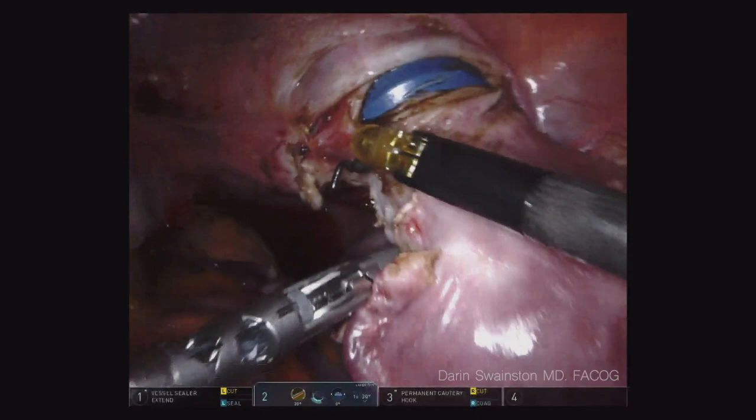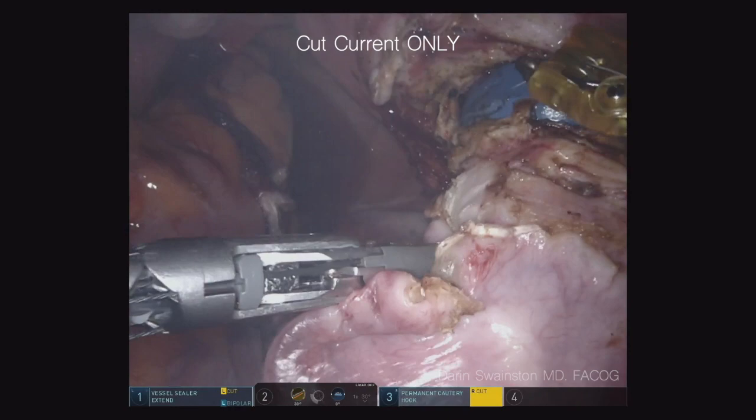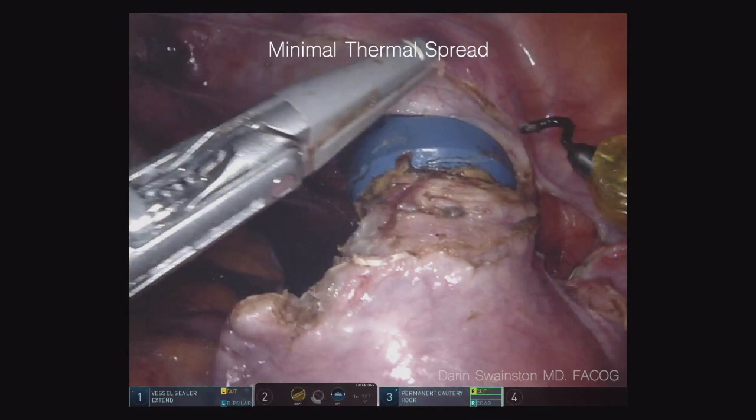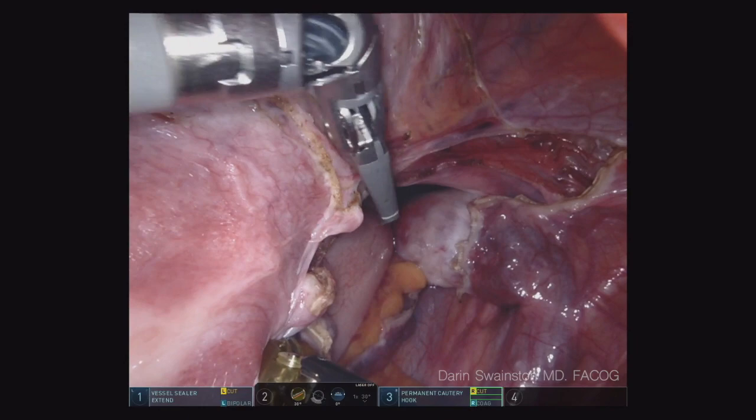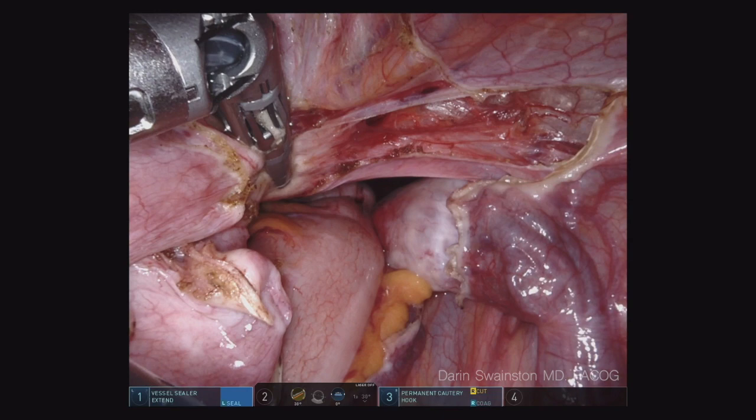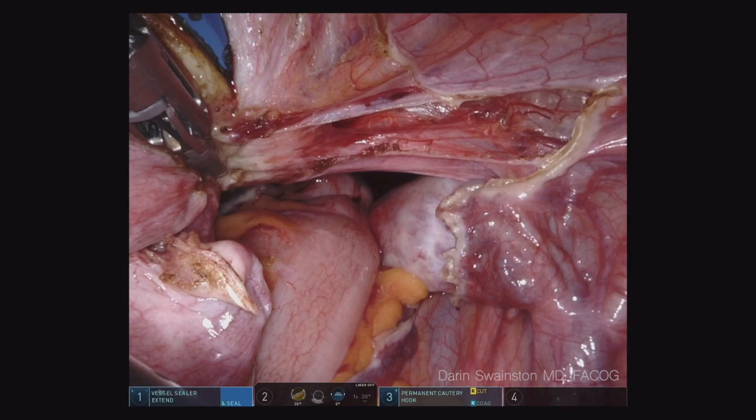I love the camera depth with the 30-degree — you just rotate and you can see around. I continue to do the same technique: lateral seal, medial seal and cut. Always when you're sealing a big vessel like this, you want that because you don't want it to fail. The company that makes all the vessel sealers says the same thing — you shouldn't have it under tension. There is literally minimal collateral spread of energy and it's really only in that vascular bundle. I'm going to go over to the other side and do the same thing — that relief cut underneath that vessel so we can slide that vessel sealer extend.